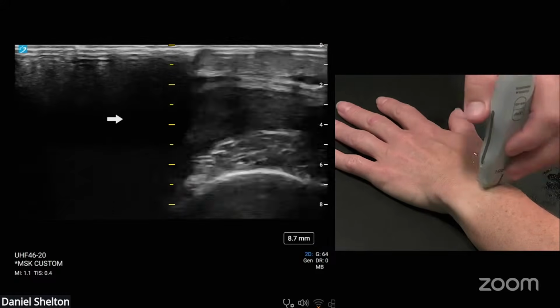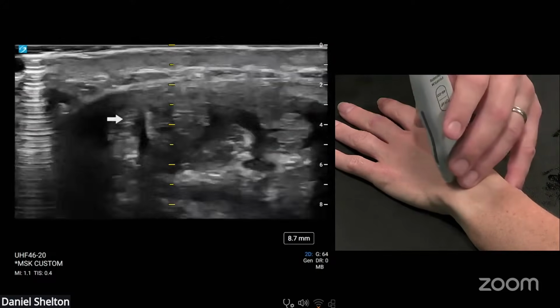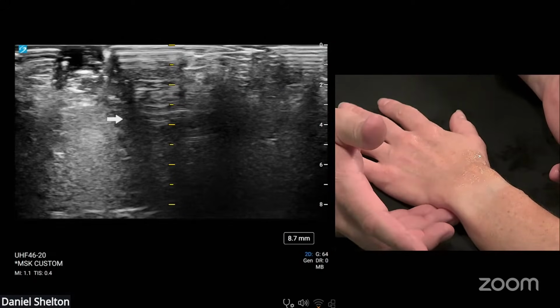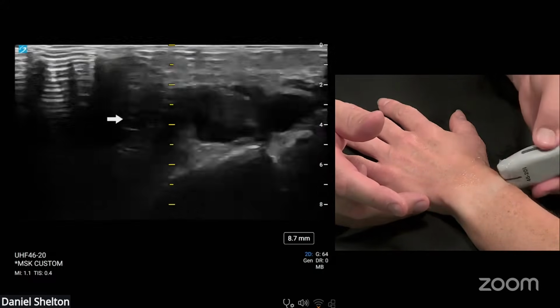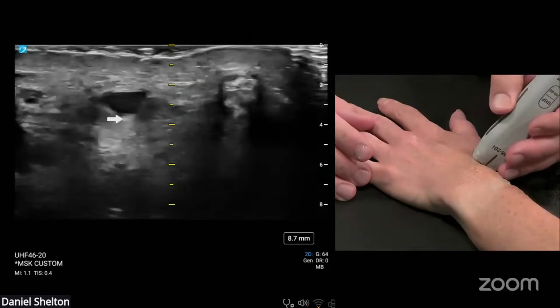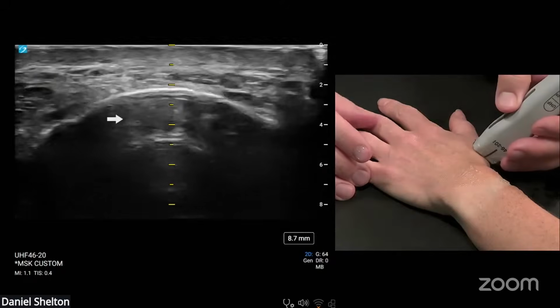But yeah, just scanning nerves. We'll have to have some requests if anybody wants to send us a list of nerves that they would like studied. The plan was to do the dorsal ulnar on the ulnar side to cover deep motor and superficial, and on the radial side, these radial branches of the superficial sensory. But we just ran out of time. There's only so much that we could fit in about an hour, but we plan on holding more of these webinars. We'll take your suggestions.